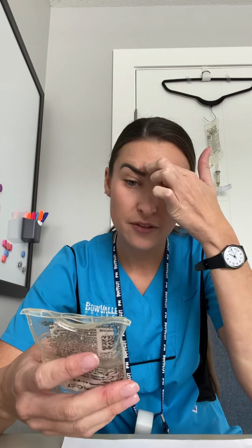So we have, that's why you do so many checks. So we have, for Allison Chinook, 4 milligrams of dexamethasone and 0.9% sodium chloride. We're giving it at 1500 on October 26, 2020. And we're giving it via IV piggyback by myself today, Jamie McClelland, and we're giving it for nausea and vomiting symptoms from chemotherapy. So there's another check.